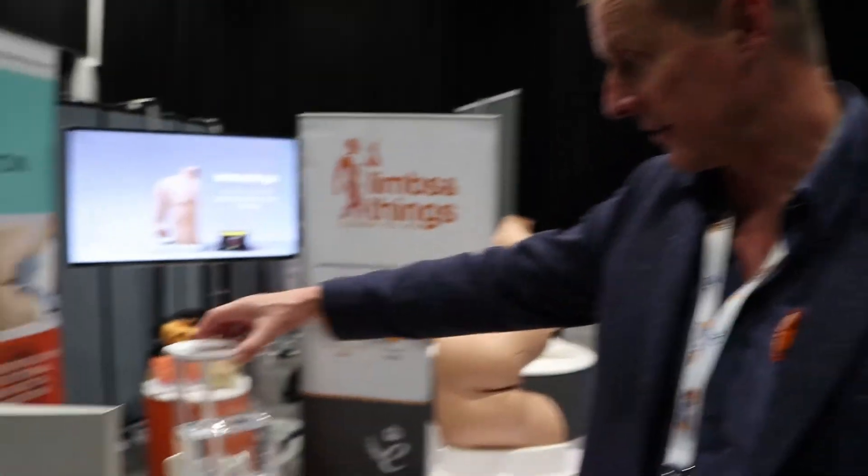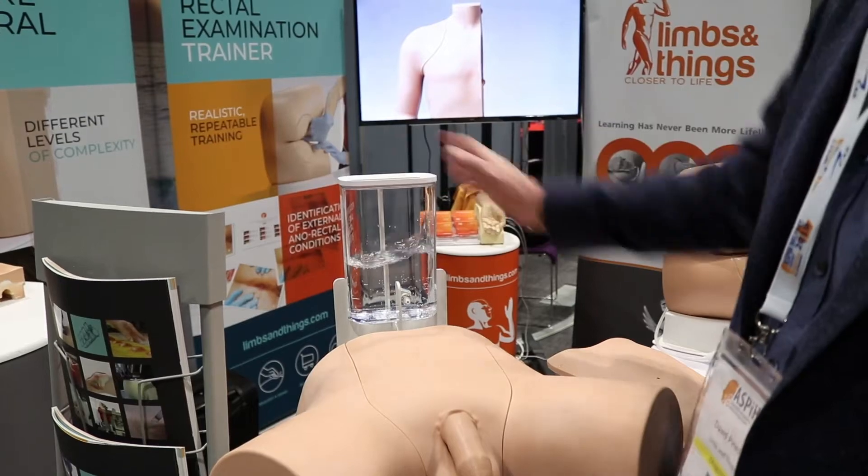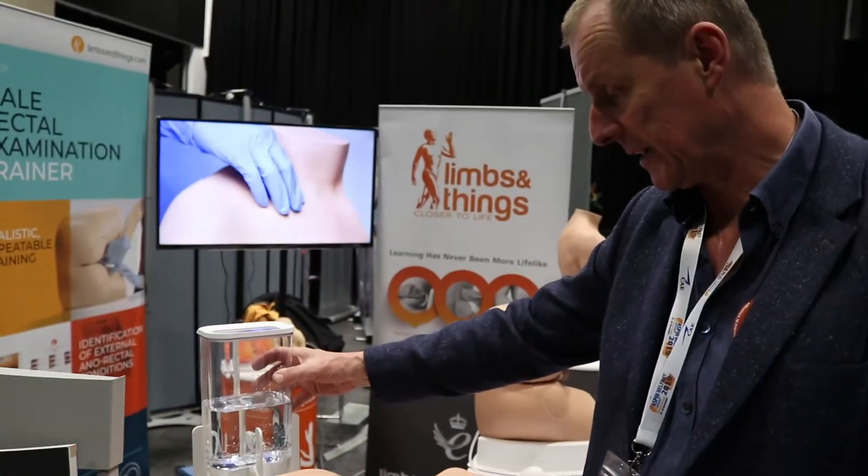Firstly, the fluid system. It's now in this kind of container that sits on a stand. You may remember the older one was hung from the frame and would sway around a little — this one sits securely in the frame.